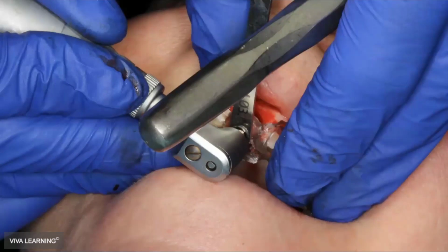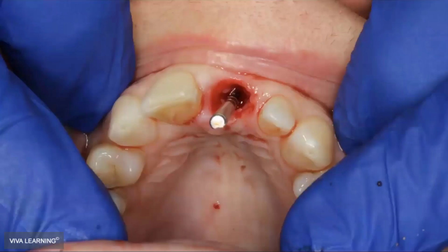And then once I have punched in past that cortical plate, or I feel like I'm just maybe 2 millimeters into the bone, that's when I like to engage my drill, because I can feel it not only going through the guide, but I can feel it indexing into the bone itself. And so that is a comforting feeling to me that I'm not getting the deflection that I'm kind of used to getting when I use a guide and it hits a socket wall or it hits a different density of the bone and you feel it kind of move on you.